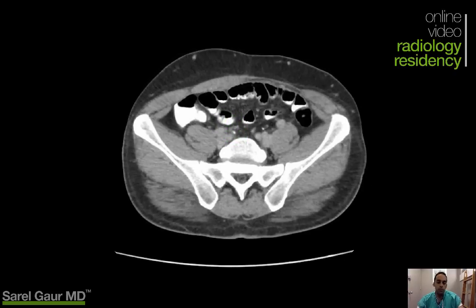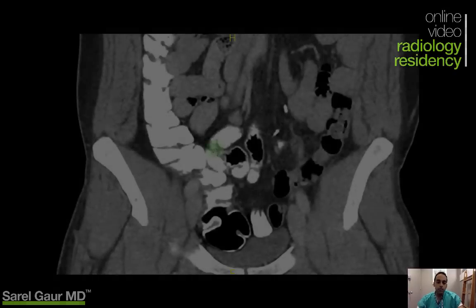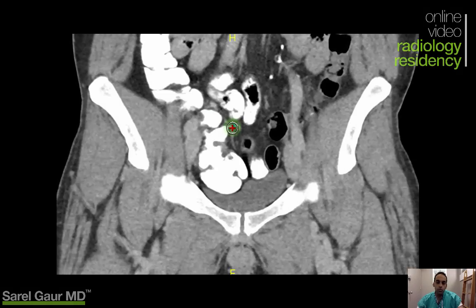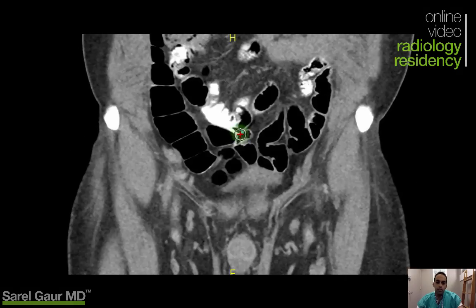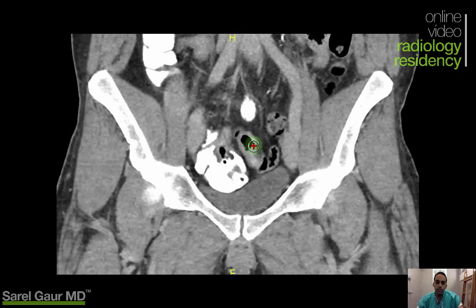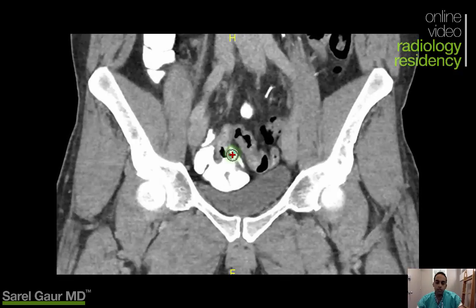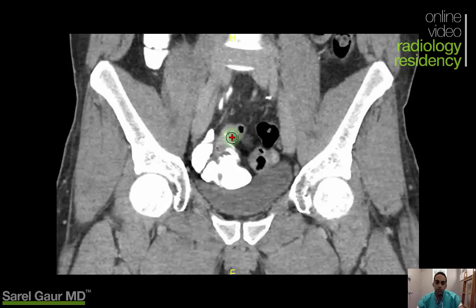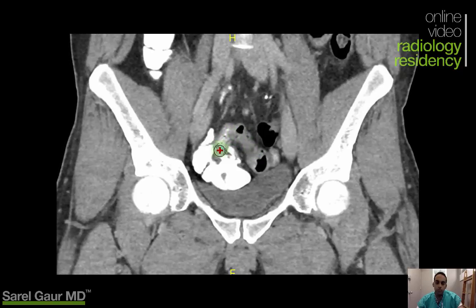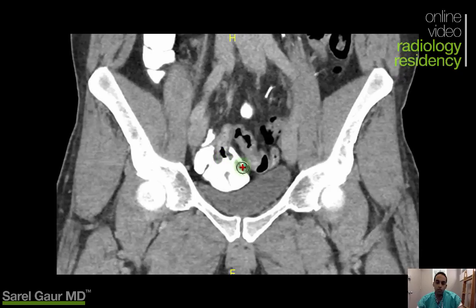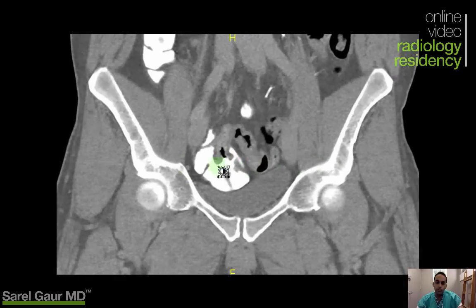I'm going to look at the coronal view to see it better. Zoomed in on the pelvis in the coronal plane, I'm going to identify the terminal ileum as the structure invaginating into the cecum. I can see the cecum, and this other caliber structure coming into it and invaginating — that's the terminal ileum. So I'm going to look just inferior to that to find the appendix.